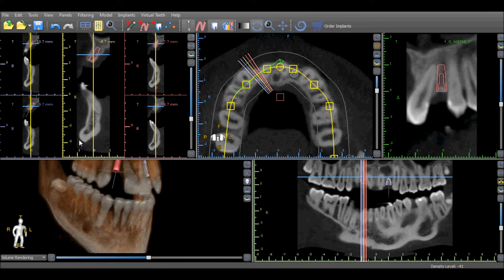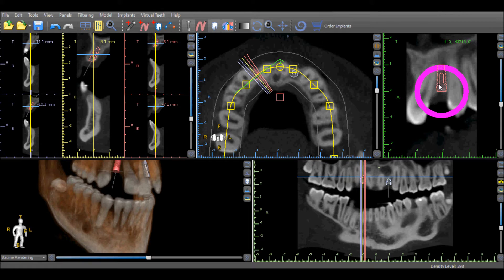The implant positioning can be modified directly in the tangential view by left clicking on the implant, grabbing it, and moving it. The angle can be changed by grabbing the circle that surrounds the implant and modifying the angle accordingly.